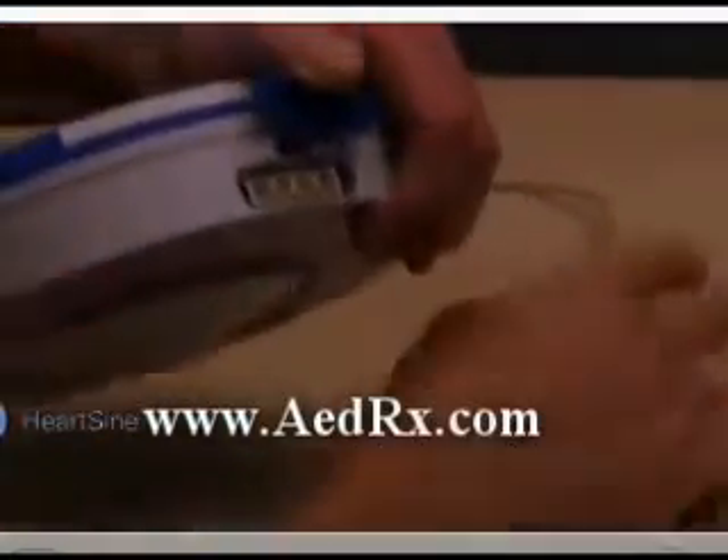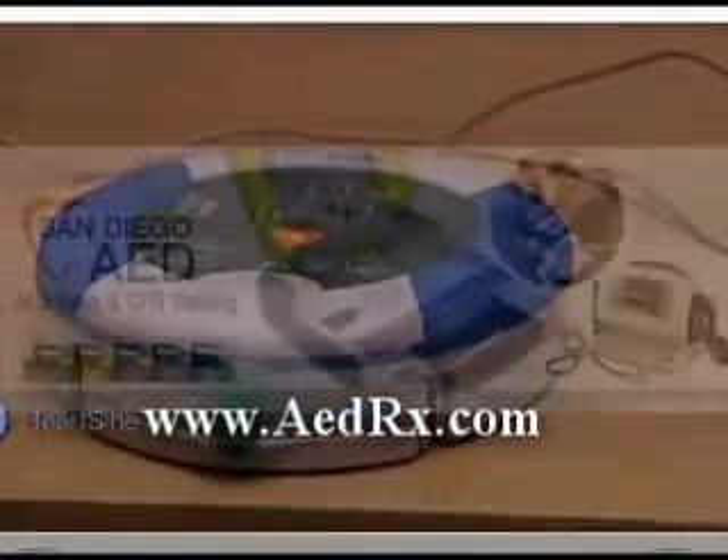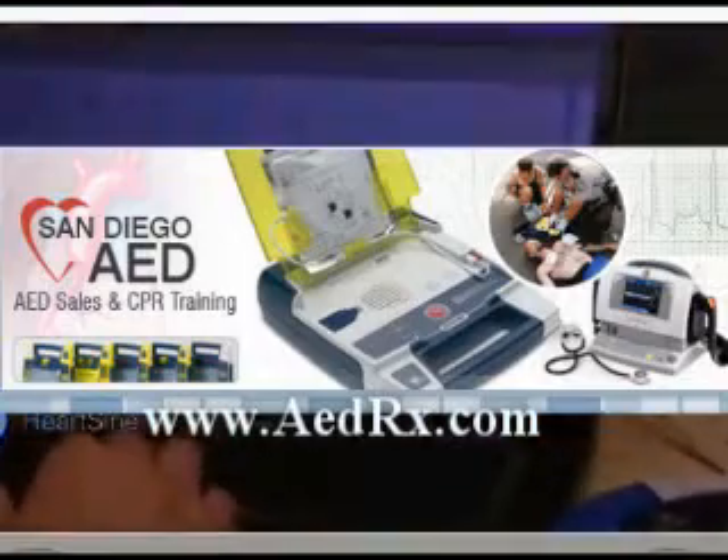The Samaritan PAD logs up to 45 minutes of heart rate information after use. A physician may want the electronic information from the device for treatment. A data cable is available from your authorized dealer or HeartSine for downloading the event data.